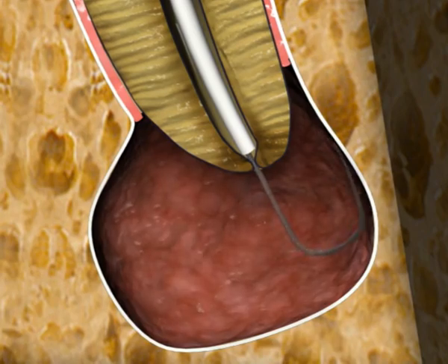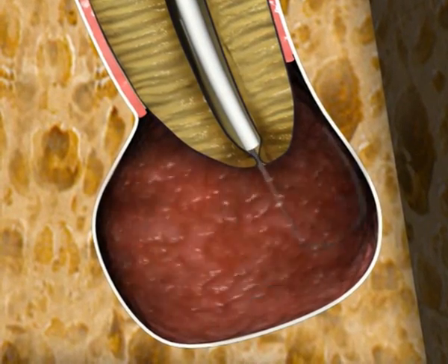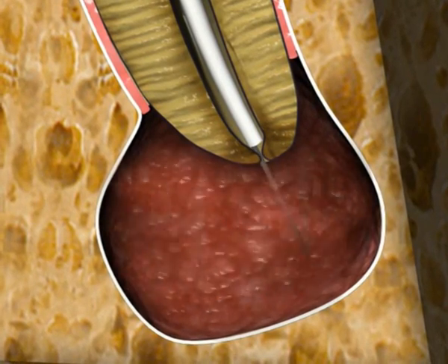The ablator is now rotated at 250 RPM for 30 seconds, thus roughly grinding the lesion tissue while leaving the bony crypt intact.